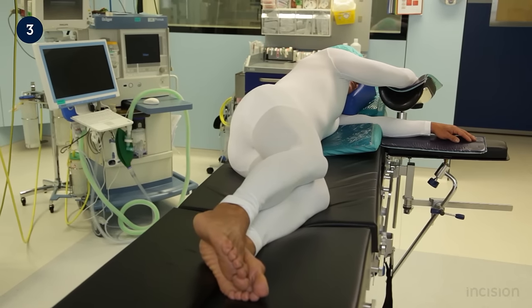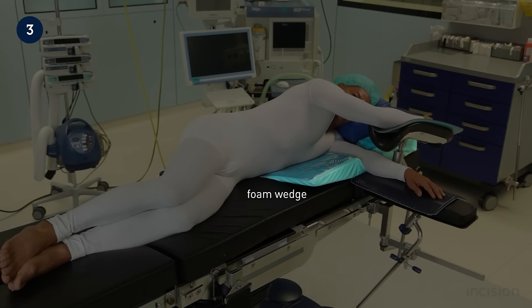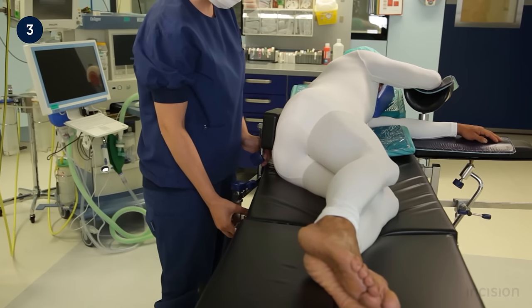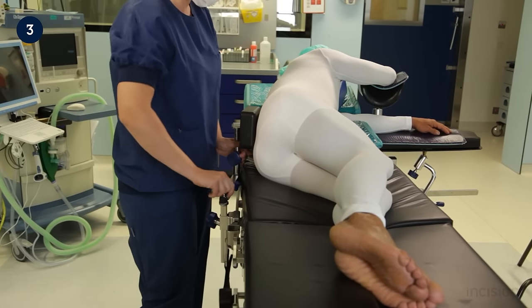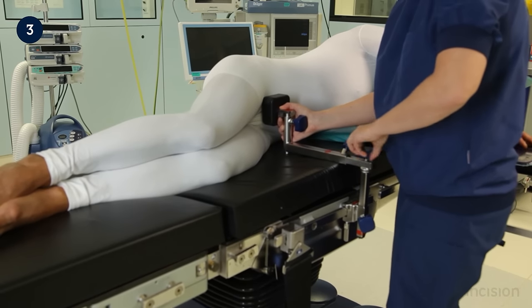Sometimes surgery requires that the patient be positioned in lateral position as seen here. For a more detailed elaboration of how the patient is placed in this position on the surgical table, refer to the course Patient Positioning. It is important to note the use of additional surgical table accessories to support the patient in this position. Besides the foam wedge placed on the table and additional arm support, body supports are placed on either side of the pelvis. First, a body support is attached behind the patient at the level of the sacrum, then adjusted to optimally support the patient with care taken not to cause pressure complications. The second body support is mounted in front of the patient at the level of the pubic symphysis, again with care taken not to cause pressure complications.